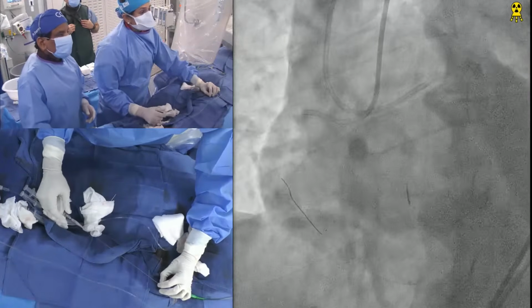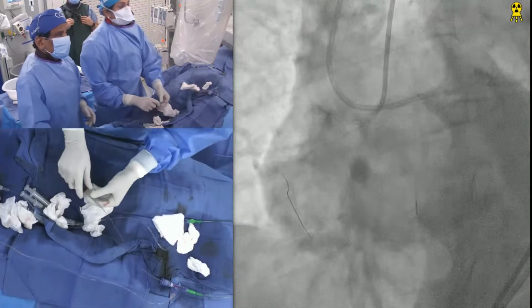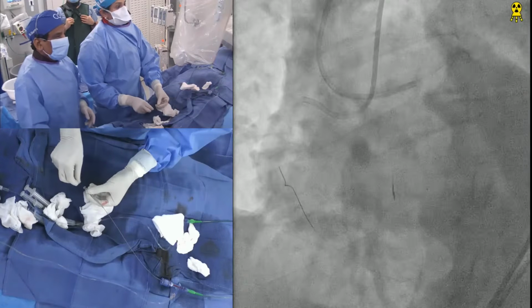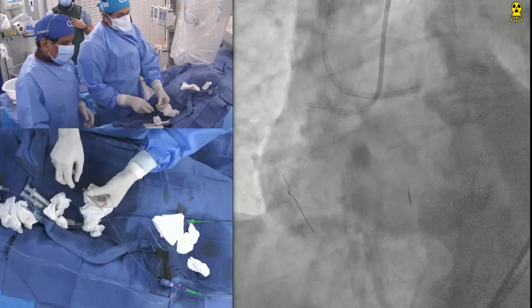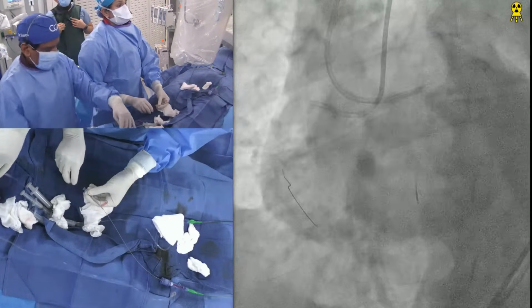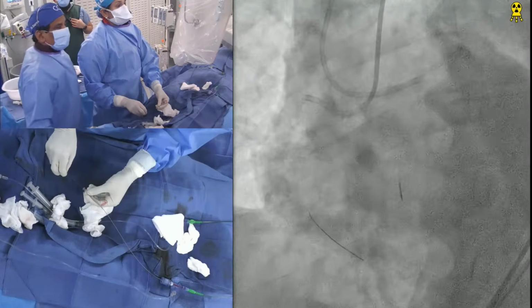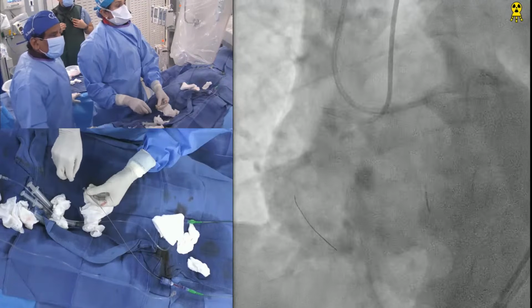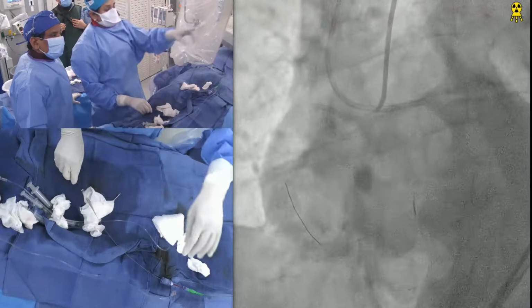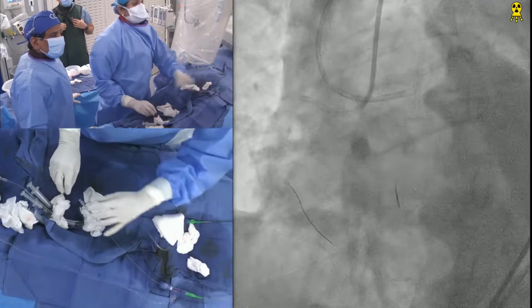Fishing in a lake with no fish. Now, if you advance the wire, does it go back into the LAD? I mean, I'm trying to go to the proximal RCA? It does not. It stops there. Some antegrade dye, so we know where we are. This is retrograde, this is a retrograde cart. So now the wire. Yeah, that's what you're suggesting. They need a balloon or some support to go further. Cannot.